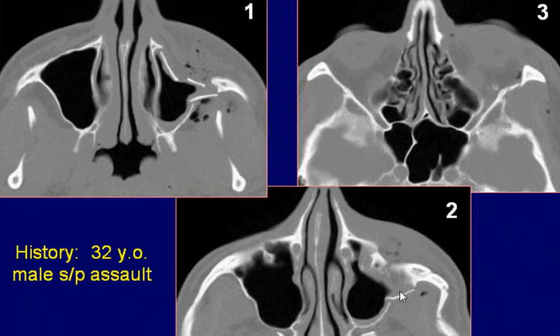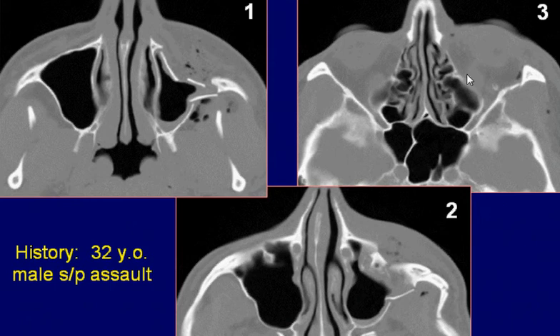Soft tissue density is present inside the antrum with suggestion of air-fluid levels. The axial images through the orbit in bone window settings show deformity of the lateral wall of the left orbit with breakage of the bony cortex.